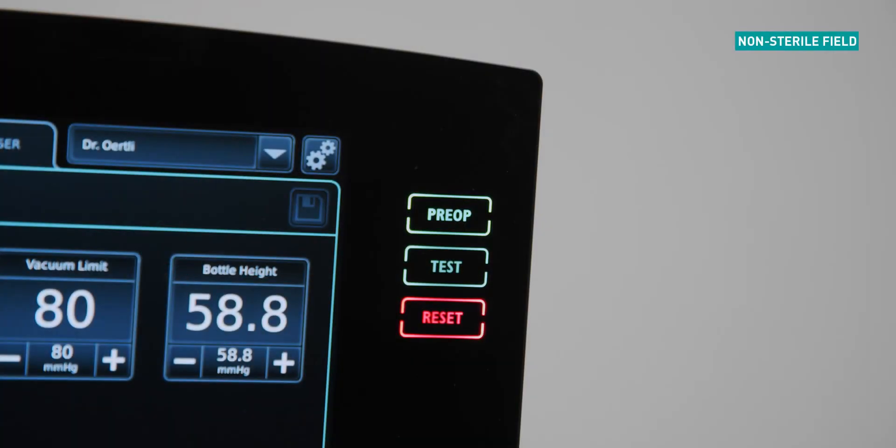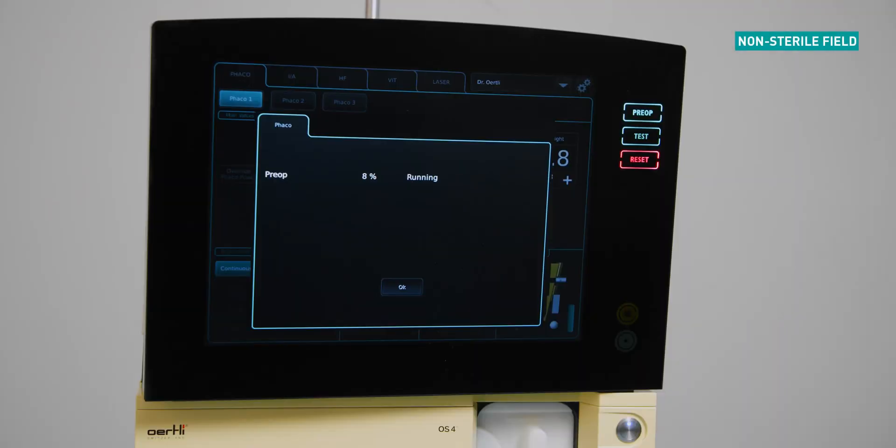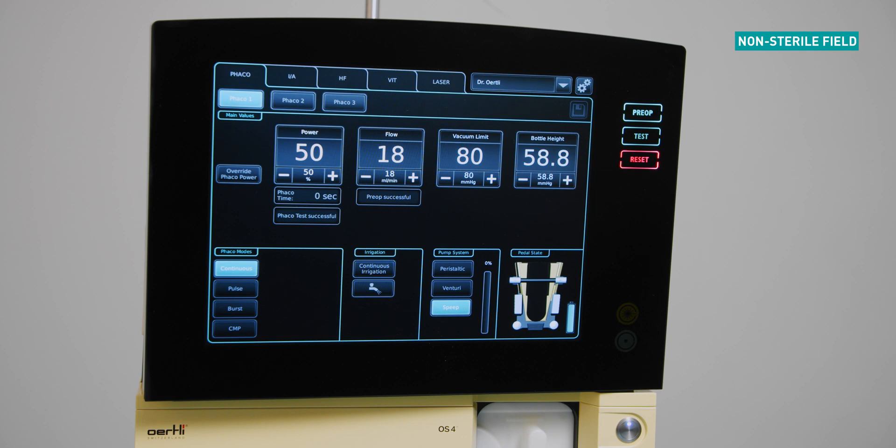Press the pre-op button to start the priming cycle. Allow the machine to complete the pre-op cycle. The pre-op cycle takes approximately one minute. The message successful will appear once the FACO test is complete. The device is now ready to use.